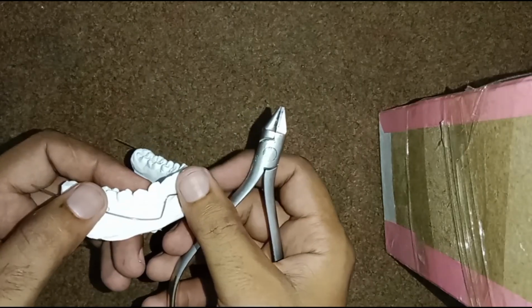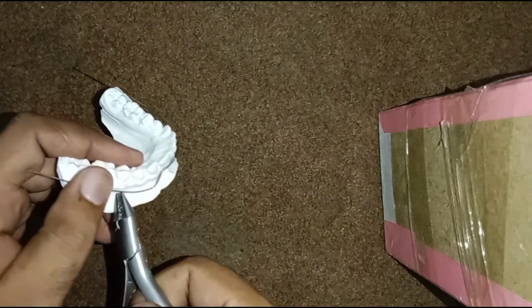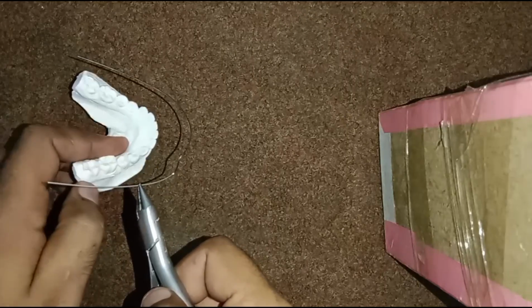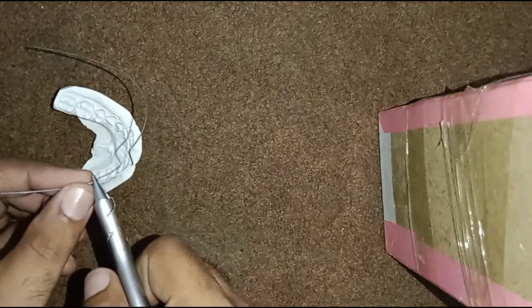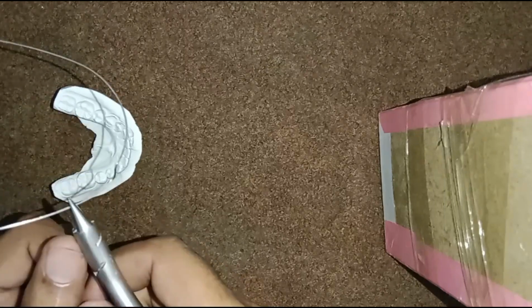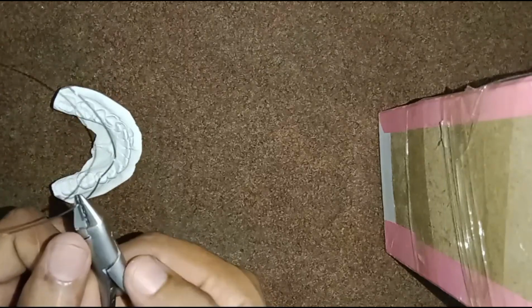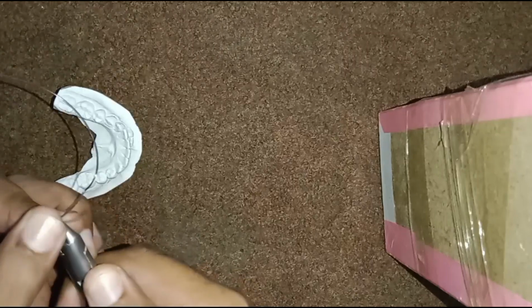We will place a mark mesial to the molar, 2-3 mm mesial to the molar. We will hold the wire. On all bends, we will hold the wire along the round side of the bird beak plier. Give the wire a 90-degree bend in the upper direction.